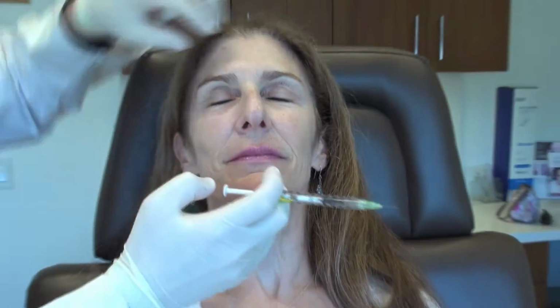I like that. I certainly don't see any major bruising. And you can compare between the two sides, and you see what a nice effect that just filling that little bit into the tear trough has on her whole face. She looks less tired. This area looks more smooth, and she looks a little bit younger, which is nice. Always nice. So, let me just put one little dot right here. Stick here.